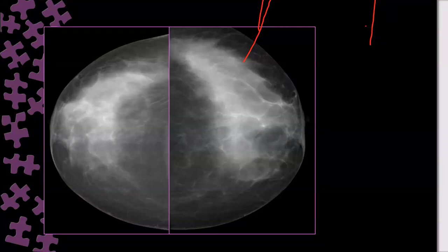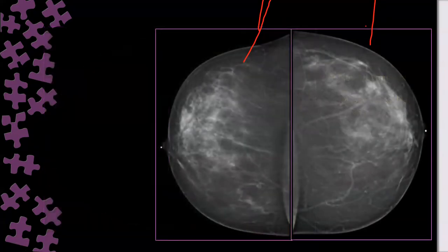Any other opinion? What about the left side? The lateral retromammary fat cannot be seen. The lateral side is cut off. The left has a missing part of the breast. So I will apply the posterior nipple line on the right, but I will repeat the left image because there is missing breast. It is not optimum due to missing lateral breast on the left side.